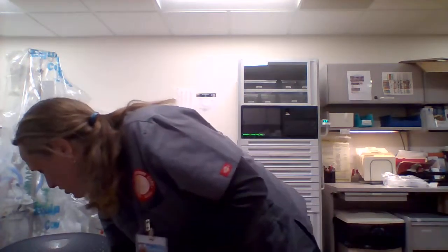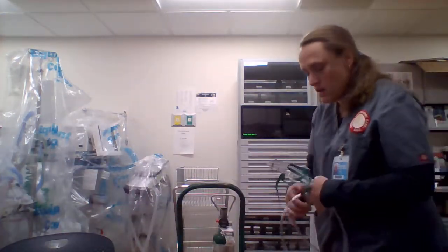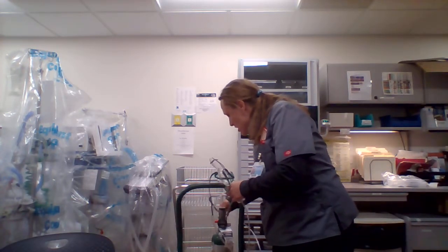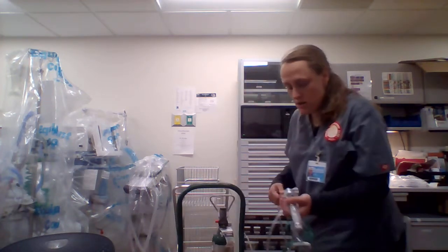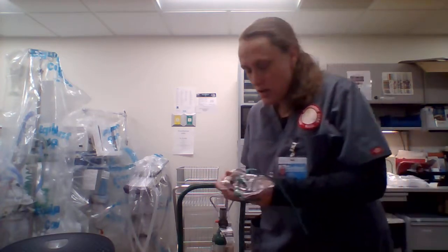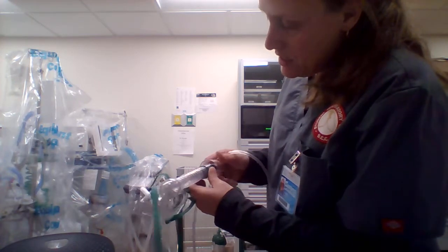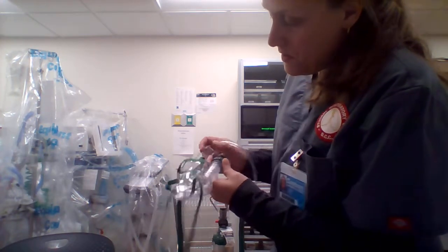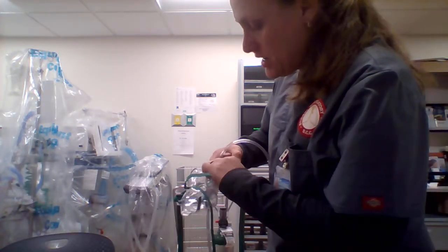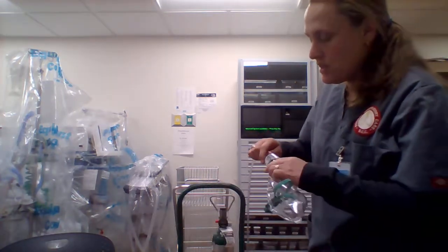Here I have my Venturi mask. This one is good for high flow. It's good for your COPD patients. It helps you regulate their FiO2 much easier. Get that on there. And it's got a dial on here, which says roughly about how much percentage you're giving. So we'll say, I can't get it to turn. Fantastic. So 40%. So the little air intake has gone down a little bit.